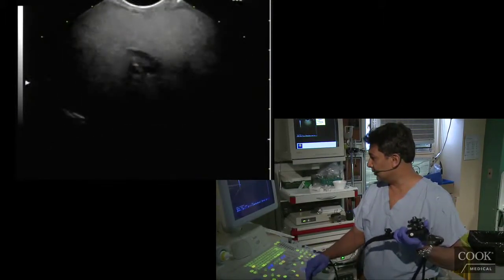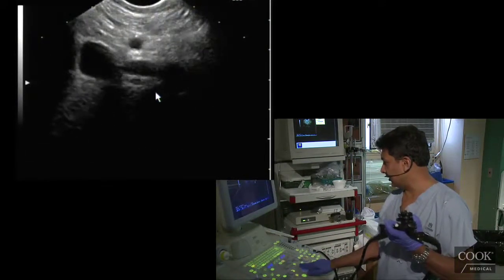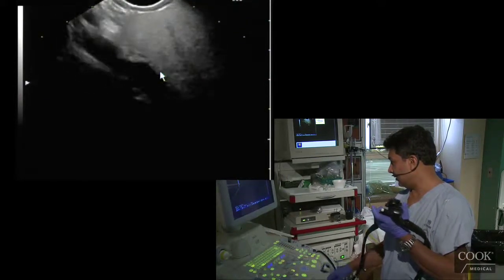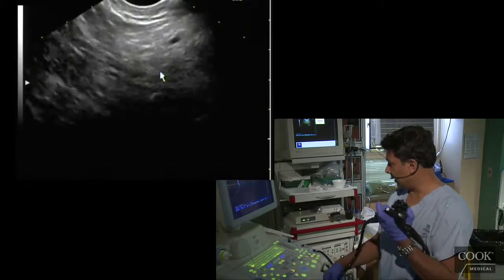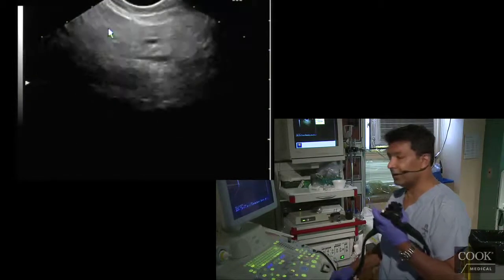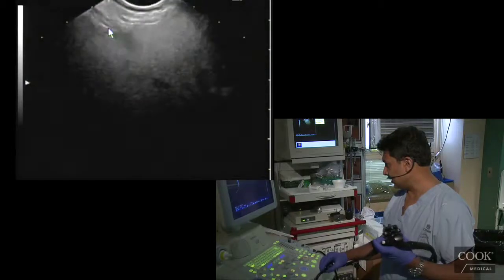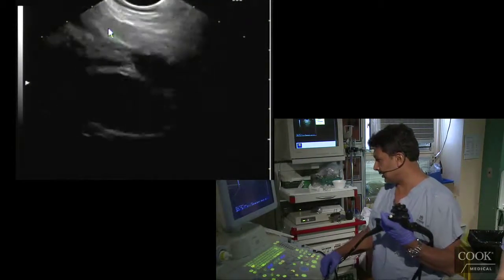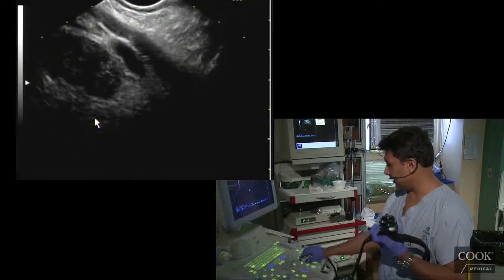This looks good, torquing. There's the vein coming out of the liver down here. No, not that. Right here. There we go, following that. Okay, and then there's her pancreas. You will occasionally find pancreatic mets as well. Okay, going out to the tail. So I'm not seeing any nodes so far that look really bad here. Let's look at her right here. That doesn't look good. Okay.